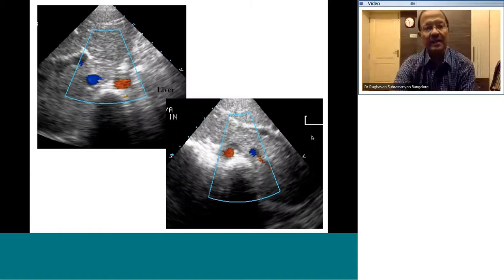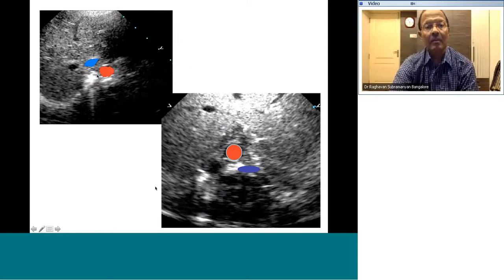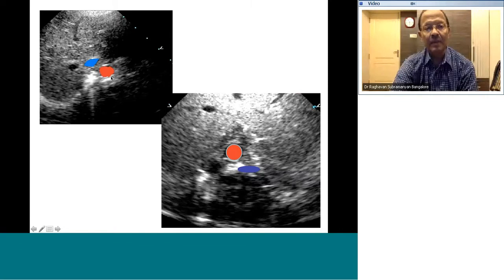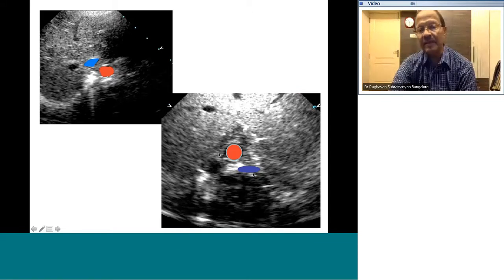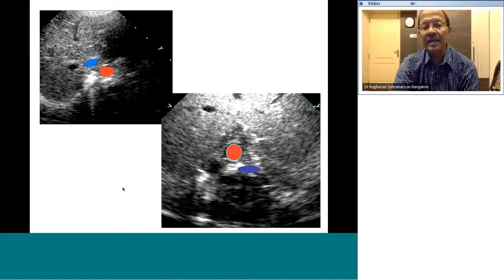In real-life echo images: situs solitus shows aorta on the left and IVC on the right of the spine. Situs inversus is the mirror image. In heterotaxy with IVC connected to the atrium, both aorta and IVC lie on the same side — aorta behind and IVC in front. In heterotaxy with IVC interruption, both lie on the same side but the IVC is interrupted, continuing as a hemi-azygous vein. The abdominal cross-section definitely helps identify visceral and atrial situs.